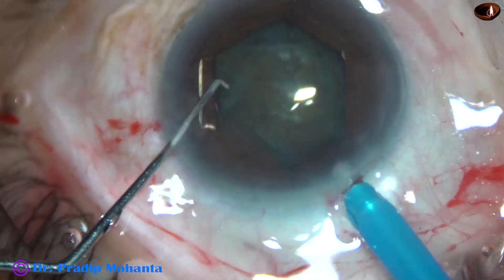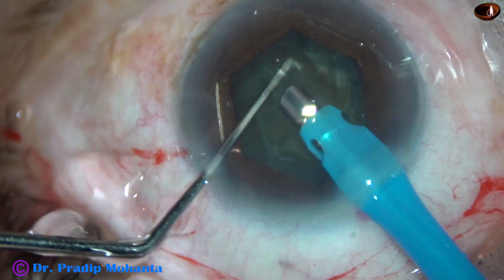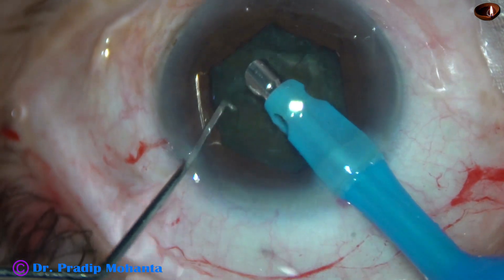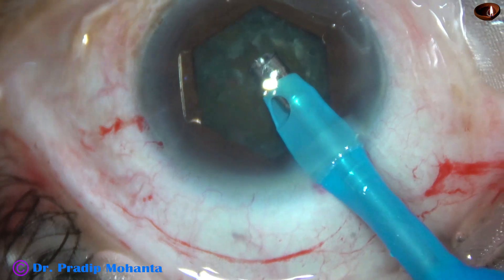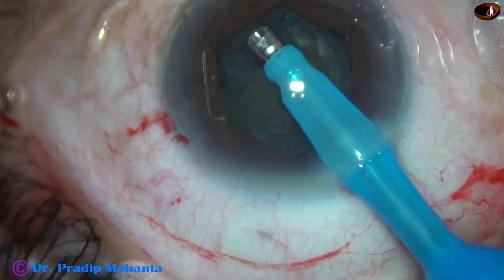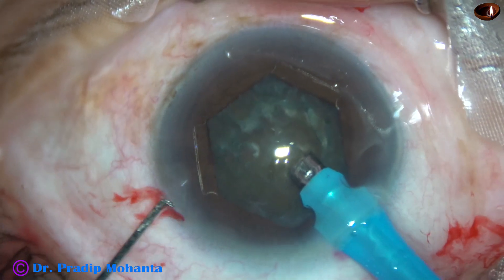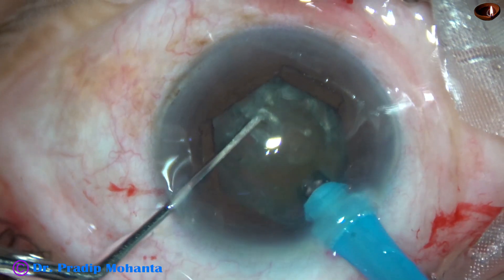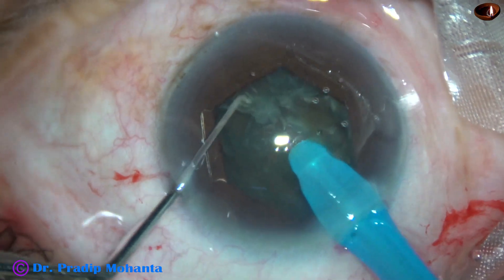Here goes the tip of the phaco needle. This is a minimally edited video — the surgery took about 12 minutes and 45 seconds, edited to about 11 minutes. Now, watch the submarine job — this is a beautiful technique.